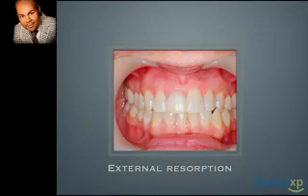Now, there have been many studies and many papers talking about being able to maintain papillas between teeth, and I've always felt that it's important to analyze the papilla ahead of time before we talk about the distance between the contact point and the papilla. So here you see we're starting out with a situation where the actual papilla on our tooth that needs to be extracted is more coronal than the adjacent tooth. Our biotype here is medium to thick.